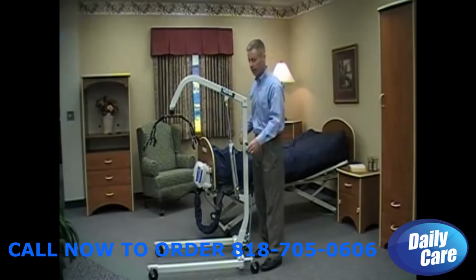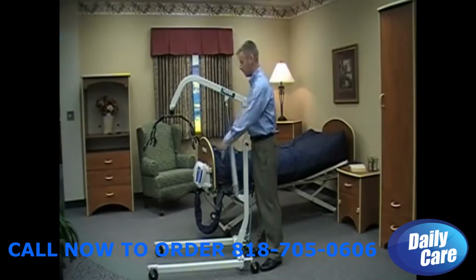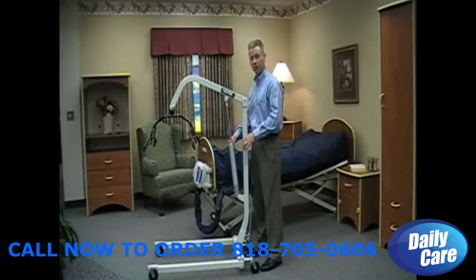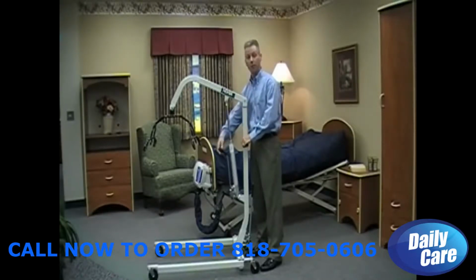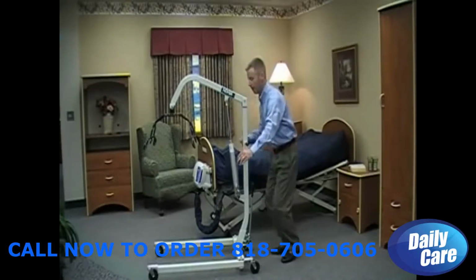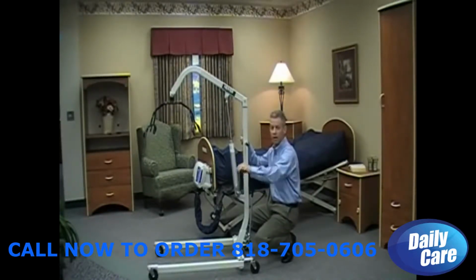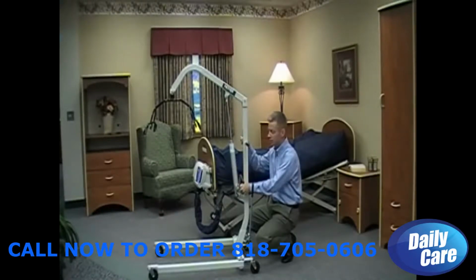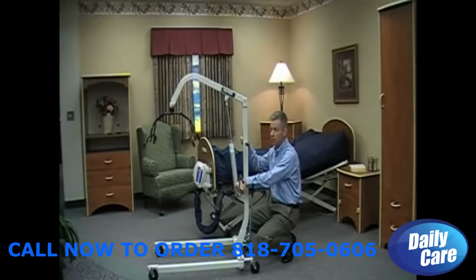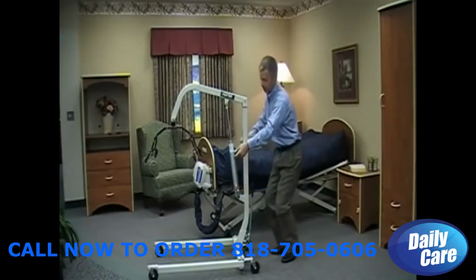As I said, it's hydraulically operated, and you have a hydraulic pump where my left hand is. That pump is actually operable on the left side or on the right side, depending on your preference and where you're located during the lift or the transfer. We recommend that you have that in place prior to beginning the lift or transfer. And it's simply operated by pushing down on that handle to raise. And then once you've got it to the correct position and are ready to lower, simply turning the dial to lower to the appropriate position, then turning it back when you're done.